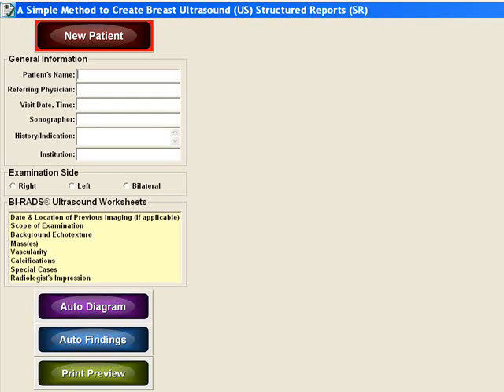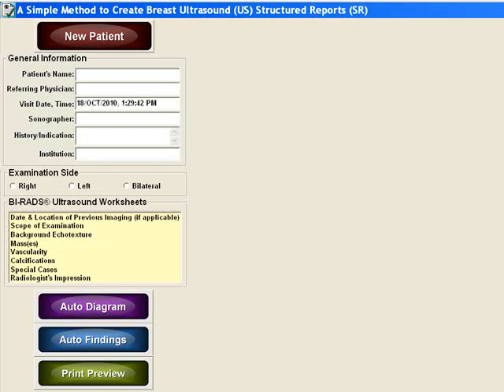To begin, select the new patient button. This will erase all the data from the prior patient, leaving a fresh blank worksheet for your next patient. Enter in the patient's general information. This can also be populated automatically by a work list from the RIS.